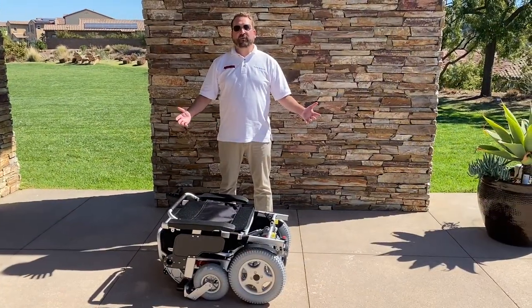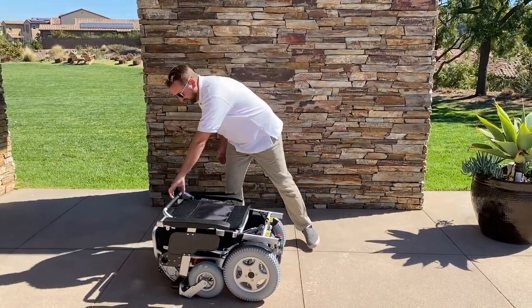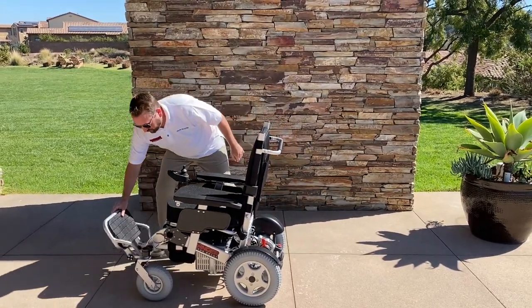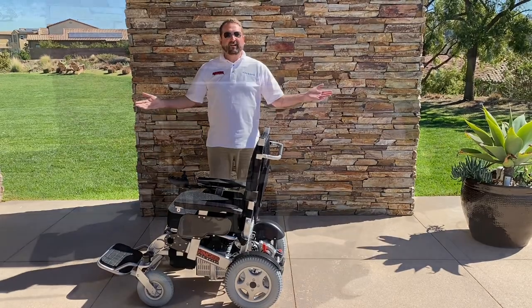It's so easy to unfold that I'm going to do it with one hand. Simply pull it up, lock the latch, and unfold the footrest. Boom — there you go.